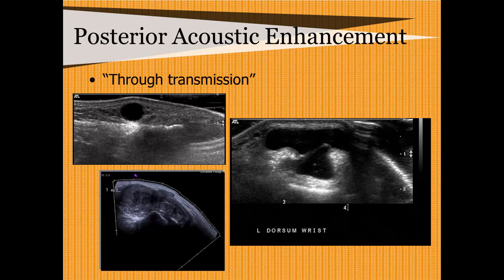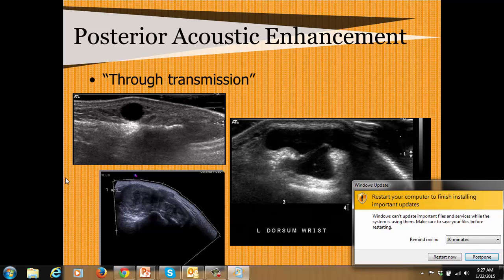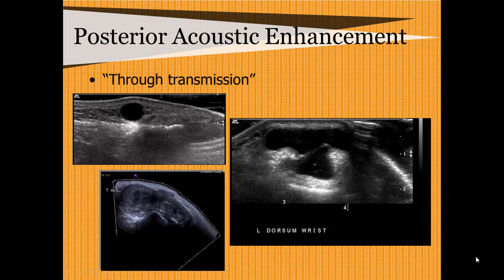Typically enhancement occurs deep to fluid-filled structures because the ultrasound system applies the same TGC to all returning echoes. So unless the operator intervenes, you would show acoustic enhancement.